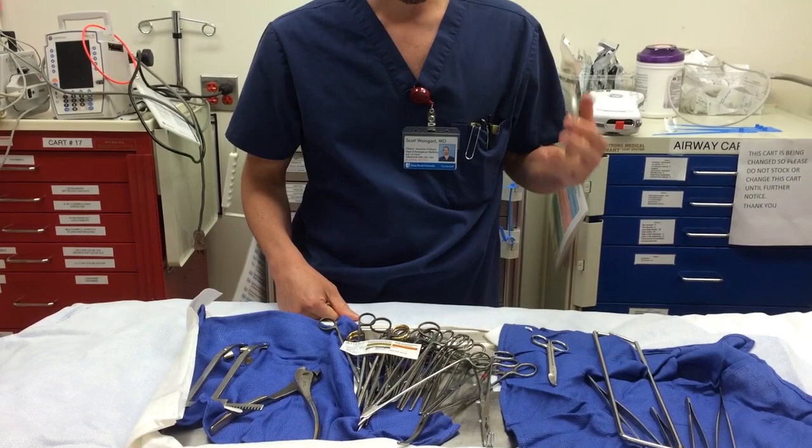You could also have sterile trauma shears in there — those will work as well. What you don't want, though some people recommend it, is the Gigli saw. I find that to be not that effective.